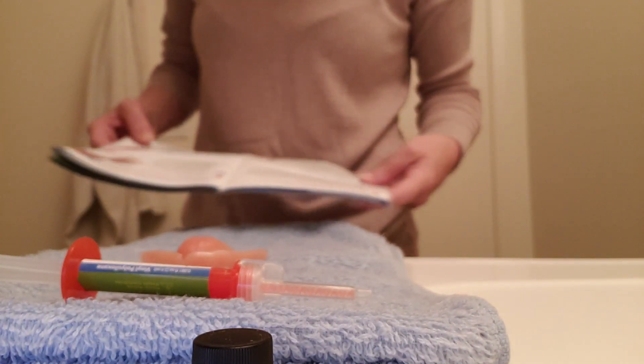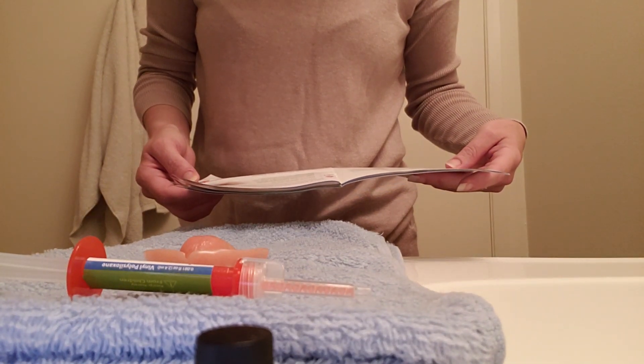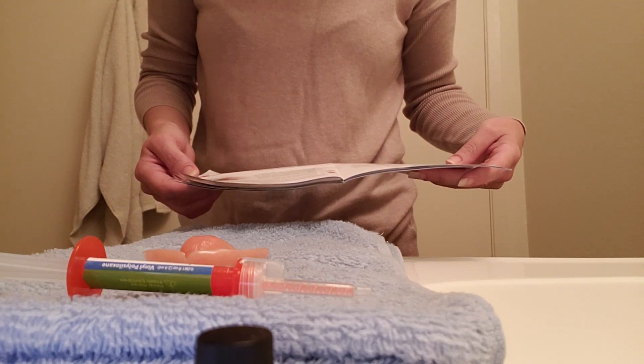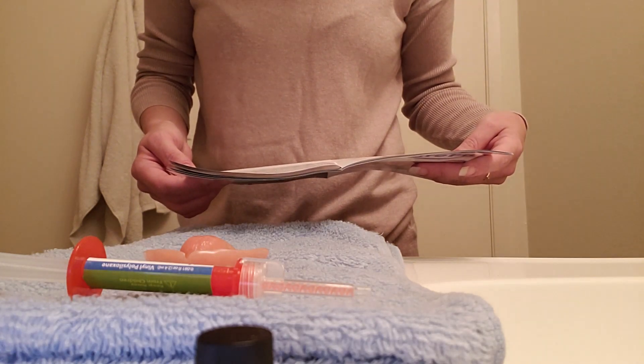All right, two minutes later — now we're going to read the next step. We applied the primer. You do not have to activate or press the plunger until you are ready to apply the silicone. You have approximately 15 seconds to work with the silicone before it starts setting. Twist the clear wing tab in the direction shown.